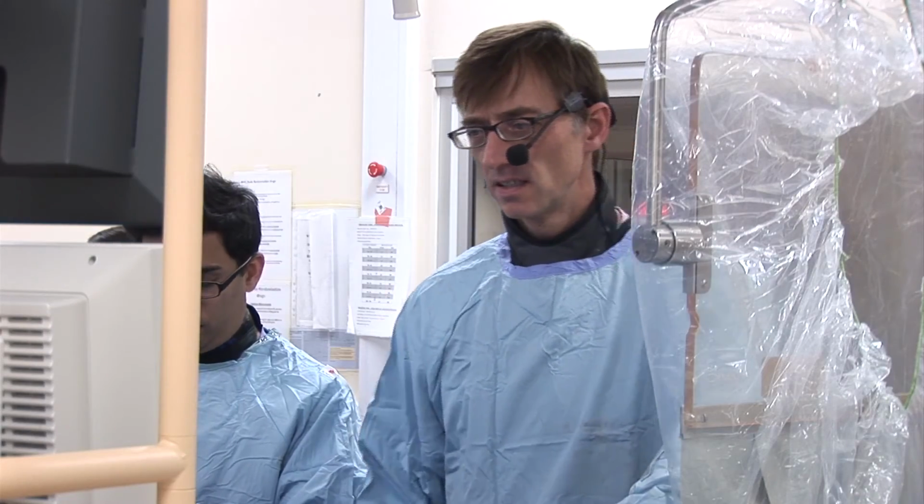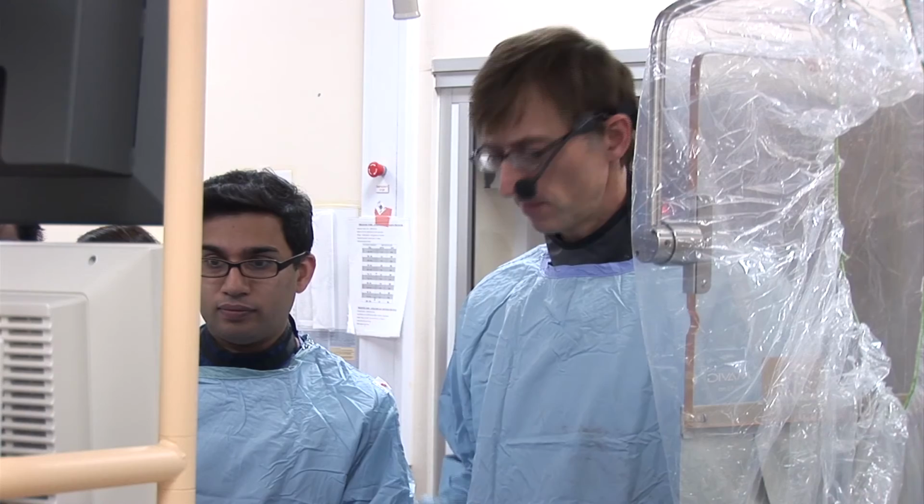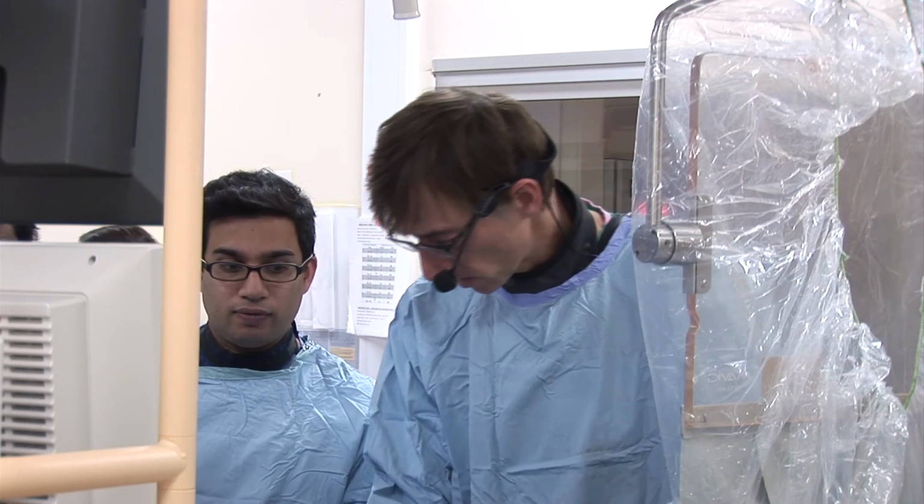And now that stent is deployed by inflating the balloon over which it's crimped. The stent is now deployed. The balloon is then deflated and withdrawn.